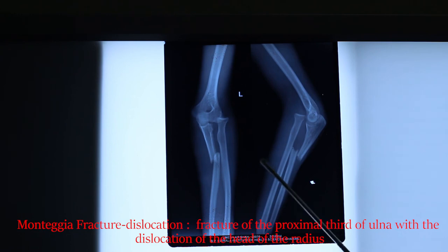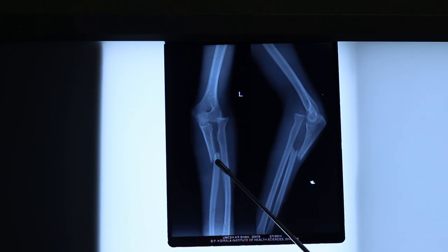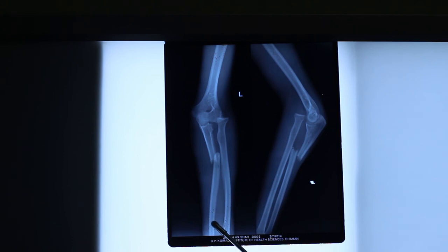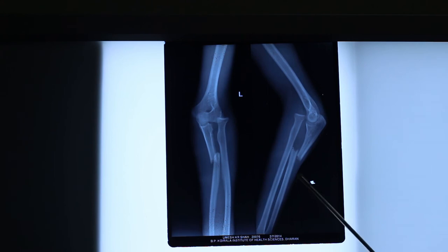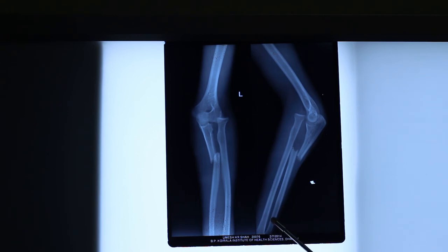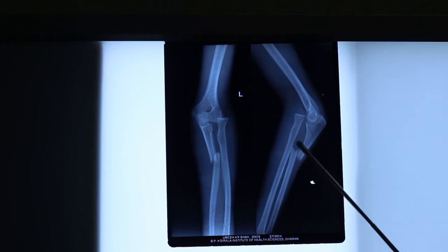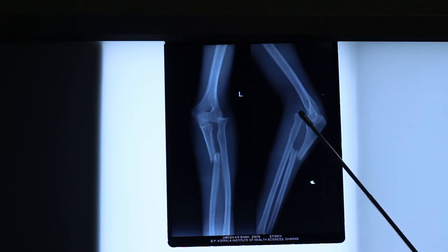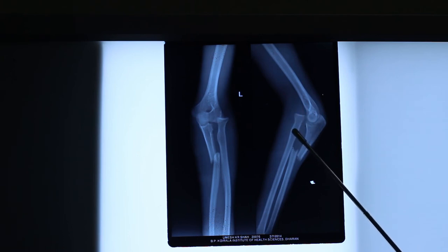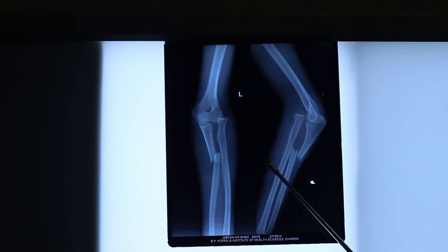In this case, the distal fragment has shifted laterally and angulated medially in the anteroposterior view. In the lateral view, the distal fragment has angulated posteriorly with the apex anteriorly. The radio-ulnar joint is dislocated anteriorly. So this is a Monteggia fracture-dislocation, and it is a Type 1 Monteggia fracture-dislocation.